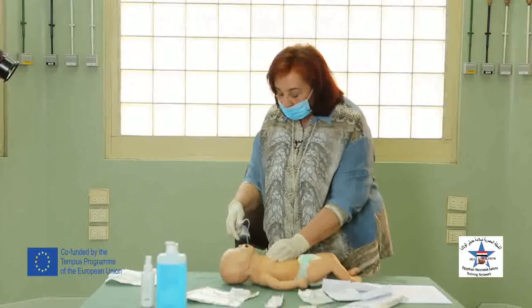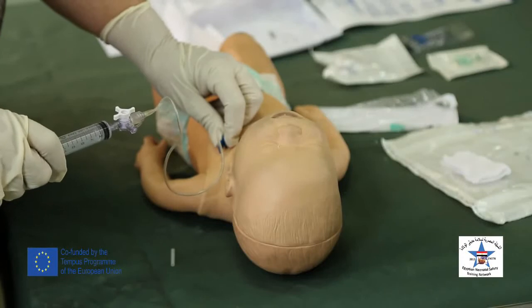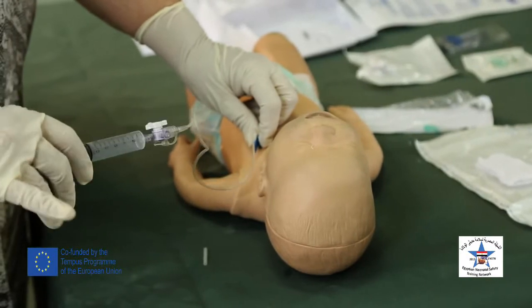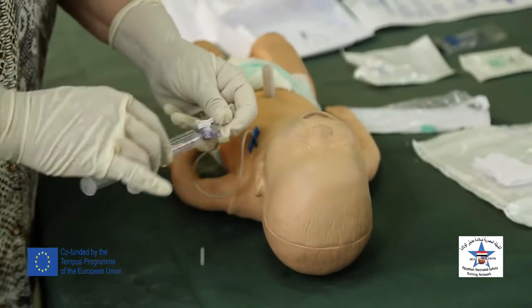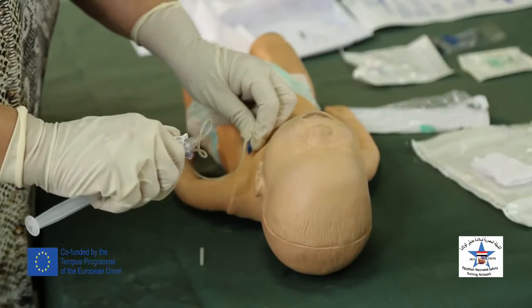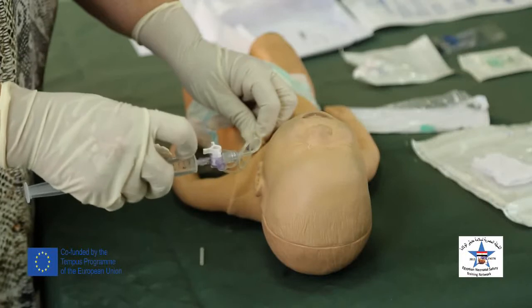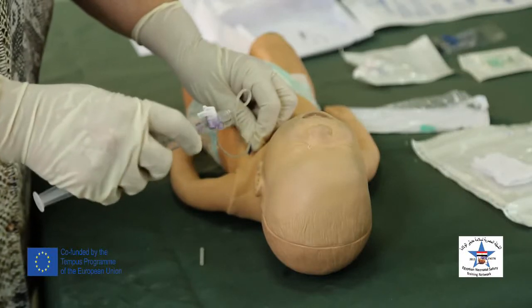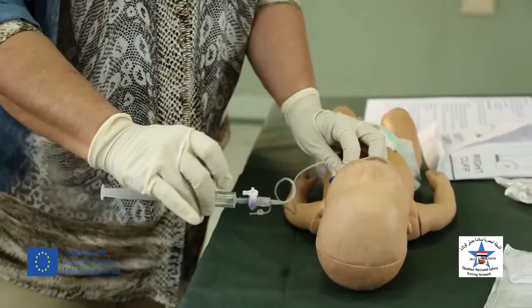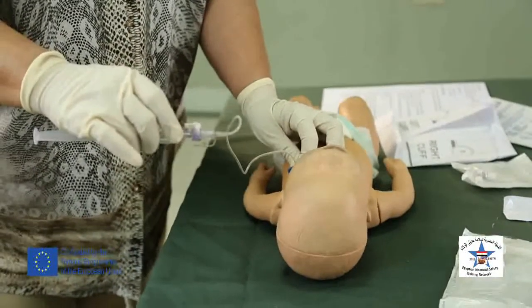Support the needle at the site of insertion and start to suck air, or withdraw air, inside the 10 cc syringe until it is full. Once the syringe is full, I will change the direction of the three-way so that I close the connection to the butterfly and align the 10 cc syringe with the port of the outer atmosphere.